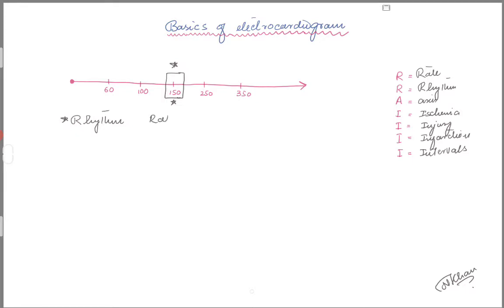When I look at the rhythm, I look at the rate. It can be atrial rate or ventricular rate. For the most part, the atrial rate will give you a lot of clues about what kind of rhythm it is. So I made a line here starting from zero. Obviously, patient is asystolic. Between 0 to 60, we know it's bradycardia.